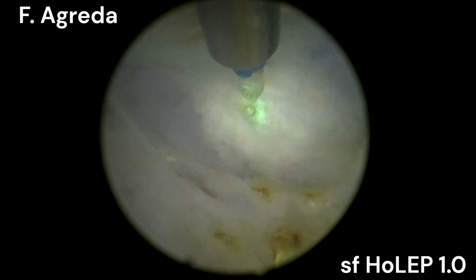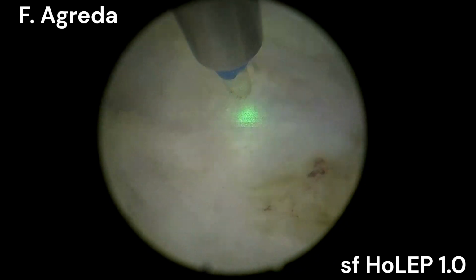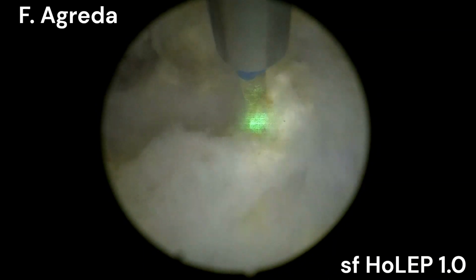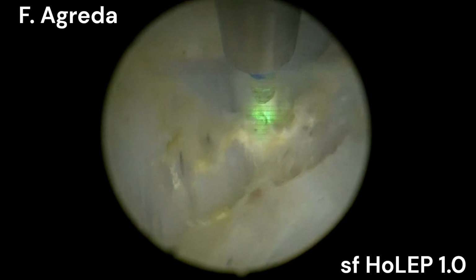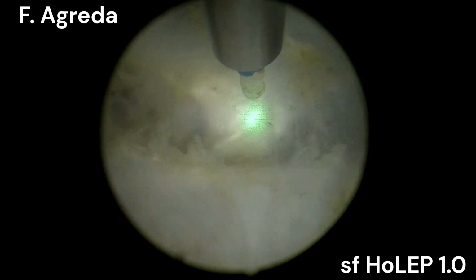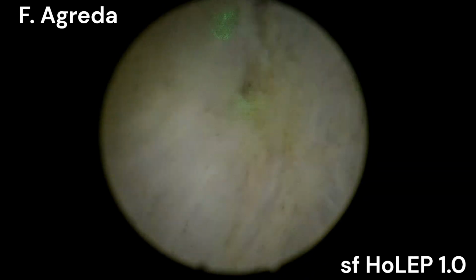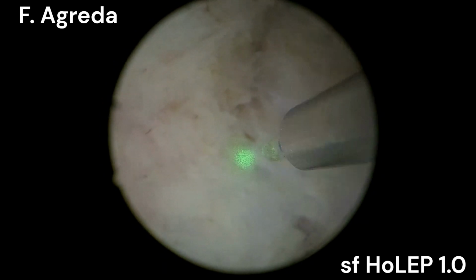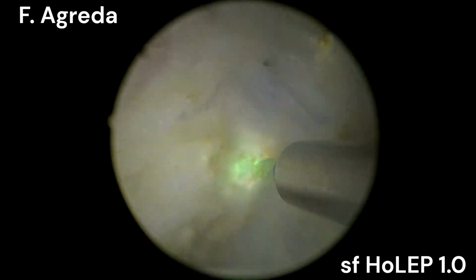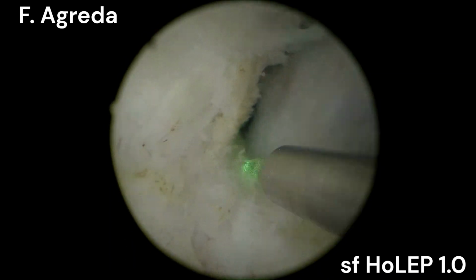I don't leave the dissection to the way the prostate is progressing. I always say to my residents that dissection cannot follow the prostate as it opens. No, you have to do it in your own direction, choosing the best way to avoid perforation, the best way to control the bleeding, and the best way to remove the maximum amount of prostatic tissue, so the patient gets a very good disobstruction and is not going to need any extra procedure in the future, any kind of regrowing of adenoma or something like that.